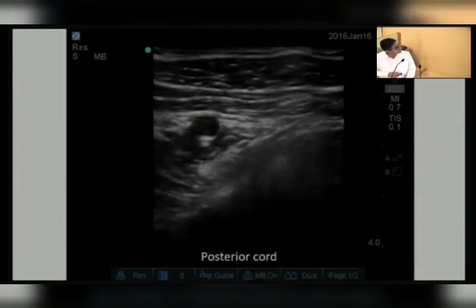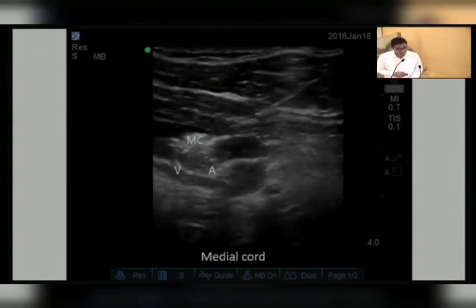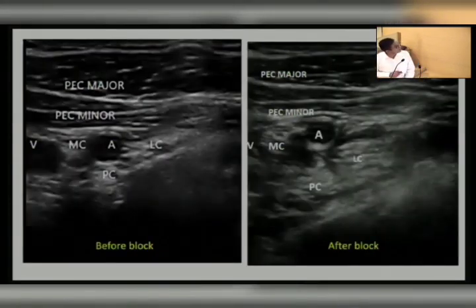So this is the posterior cord injection, this is the lateral cord, and this is the medial cord. This is pre-block scanning, and this is after block. See, the cords are a little bit better visualized after drug injection. So this is a peculiarity in this approach: the cords are not well visualized every time. They are not identified every time, but after drug injection we will come to know. And this position we will find most of the time in the lateral approach.